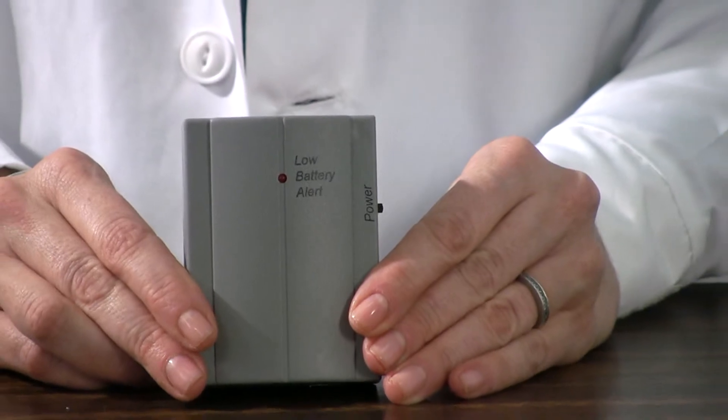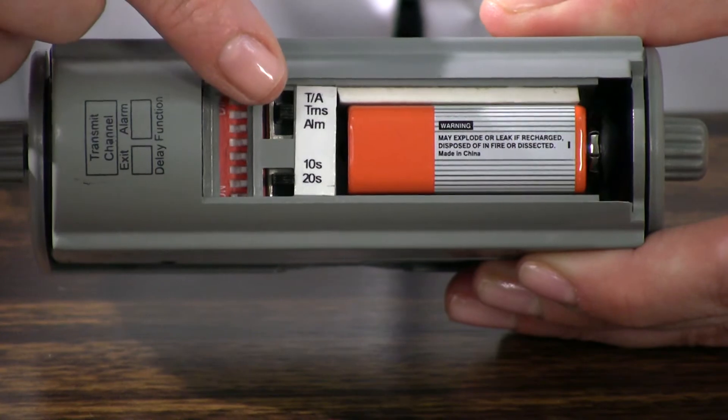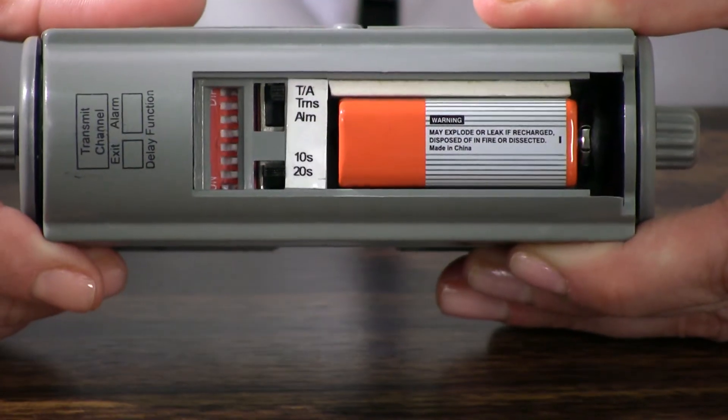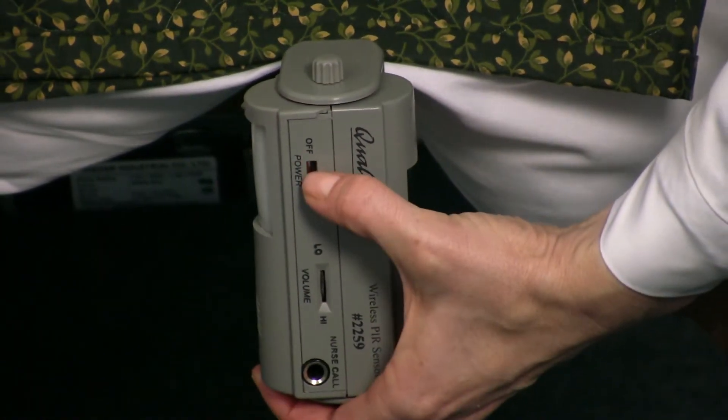Now set up the nurse call receiver. After installing a 9-volt battery, set the eight position dip switches to match the settings of the PIR alarm unit. Make sure to set the transmit mode on the alarm to either transmit or transmit and alarm to enable communication. Now insert the nurse call plug into the wall's nurse call jack and turn the power switch to the on position. To operate the unit, turn the PIR device on using the on-off selector on the side, adjust the volume settings as desired — it is now ready for use.